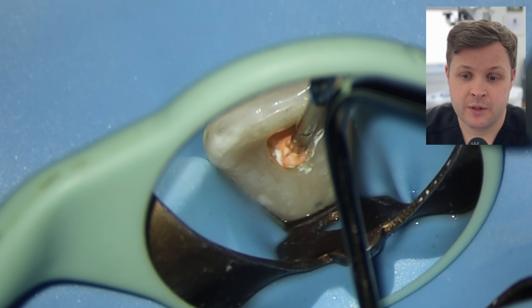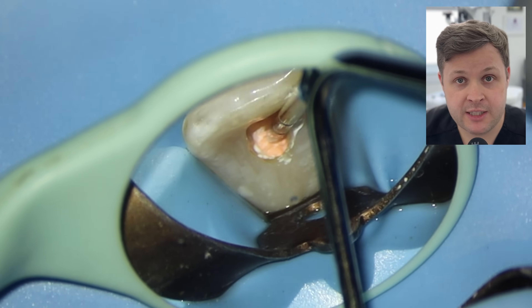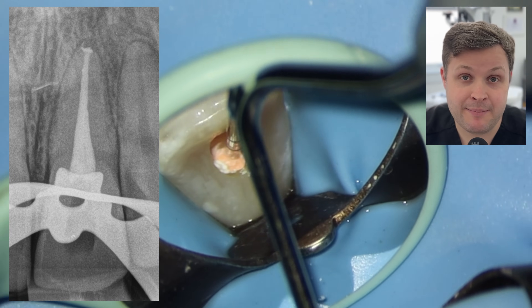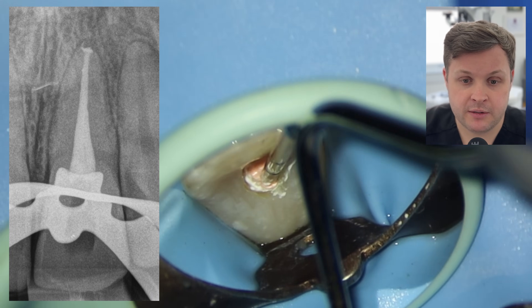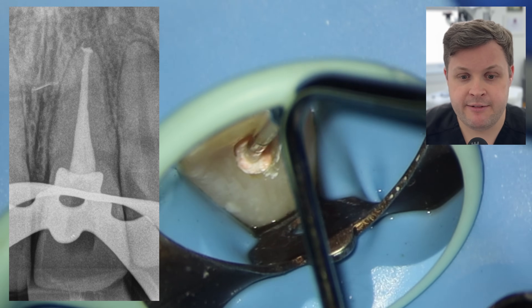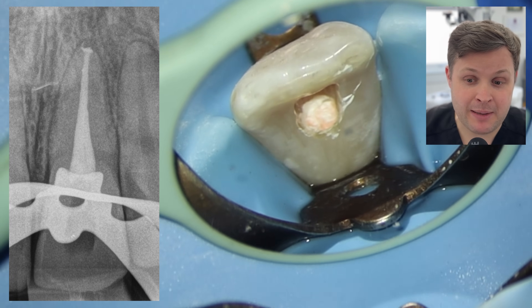Once we've put our accessory cone in, I'm just going to compact it down with a Mac 2 plugger. Before we come to fill this tooth, I'm going to take a comfort radiograph — because at this point, if you've made any mistakes or any voids, you can correct them really easily. We look at the post-op and it looks absolutely fantastic — it's all filled, we've got that kind of mushroom shape at the end of the tooth, and I'm really, really happy with this obturation. Of course, we don't know why the apex locator was firing off early — maybe it was a lateral canal. It's not obvious, but I am happy with this.